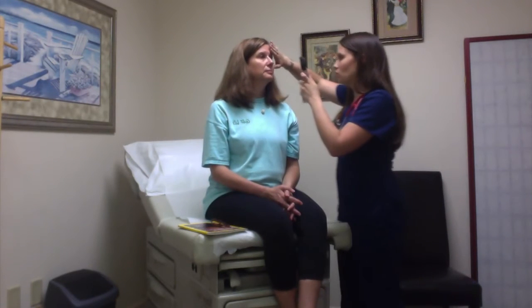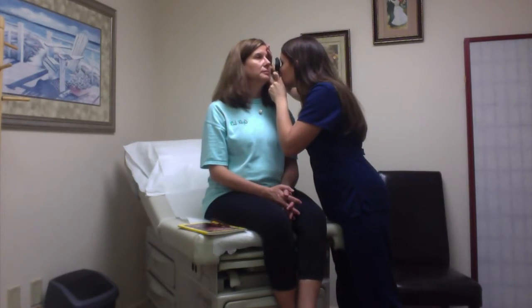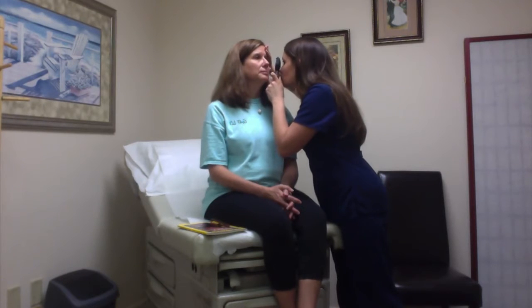I'm going to get you to take your glasses off for this one. Okay, and I would hold my hand just here to balance. I'm looking for the red reflex. I'm also looking at the macula and then the arteries and vessels in her eyes.